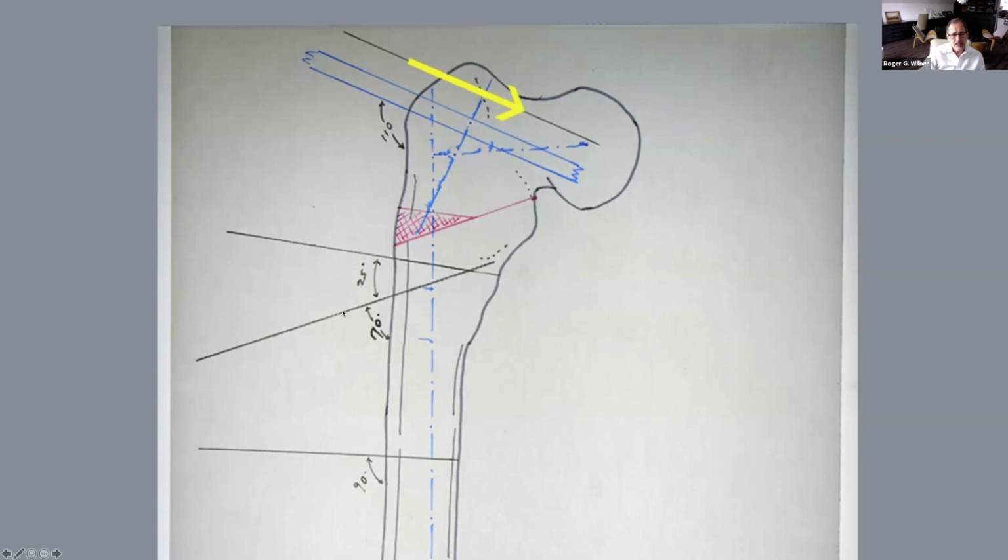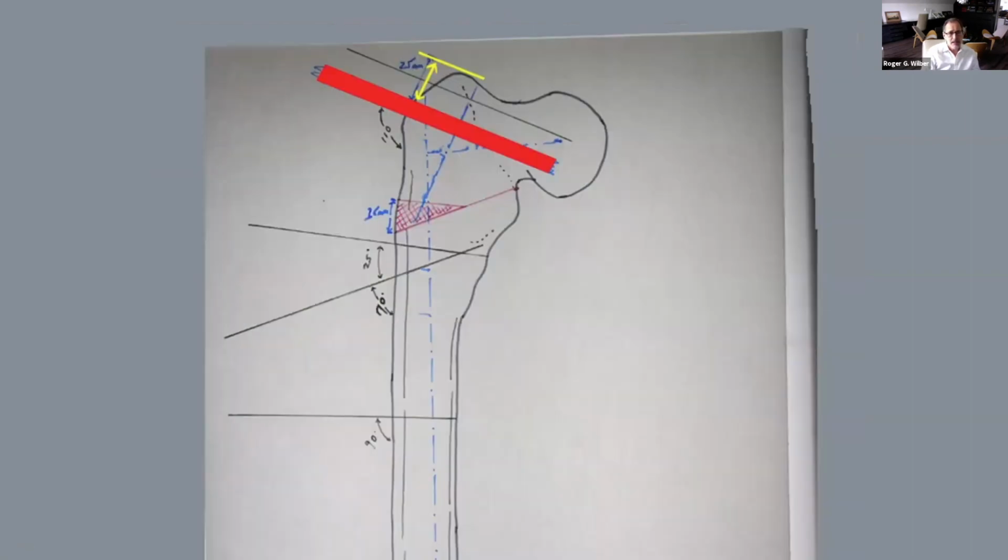Keith mentioned that early on, you may want to put these pins in a location where you can rest the saw blade on the pin and cut on the pin. But in general, I find that the pins get in my way, so I tend to keep them a little bit out and just use my eye to guide the cuts.